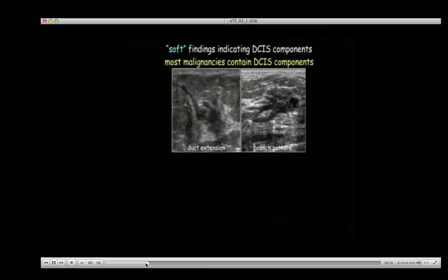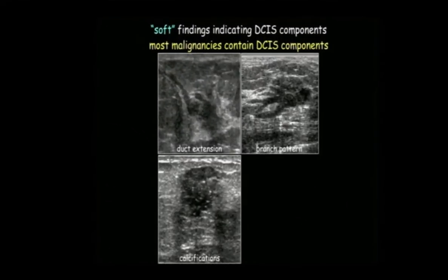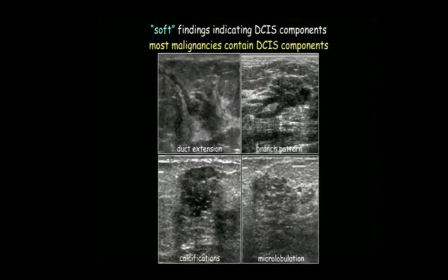Here are the soft findings. The duct changes include duct extension and branch pattern. These are enlarged ducts, maybe distorted. They might be hypoechoic, beaded, or angular, but they're outside of mass. In the old BIRADS they were called 'effect on surrounding tissue'; in the new BIRADS they're just called duct changes.